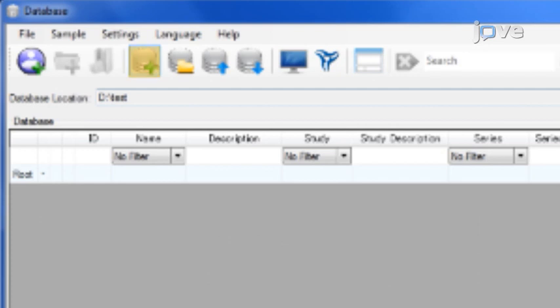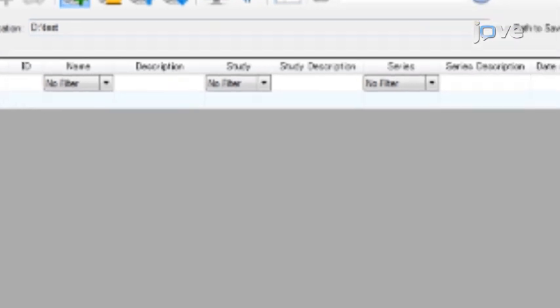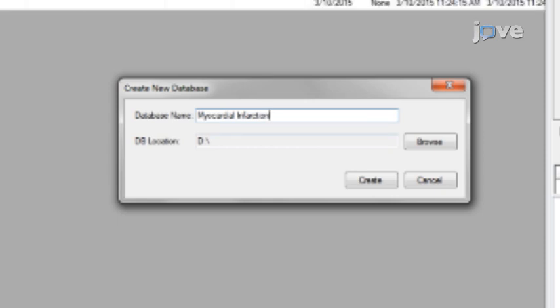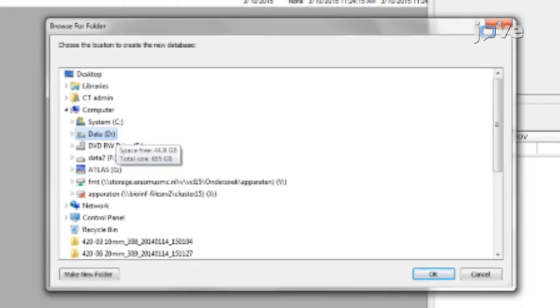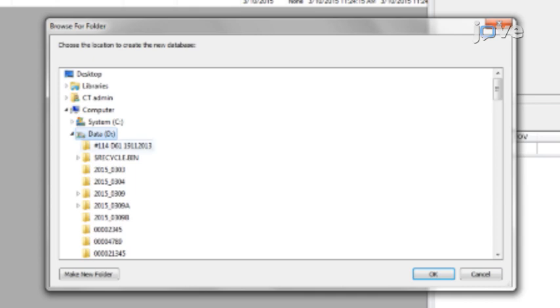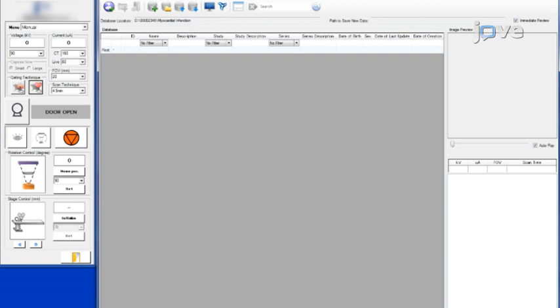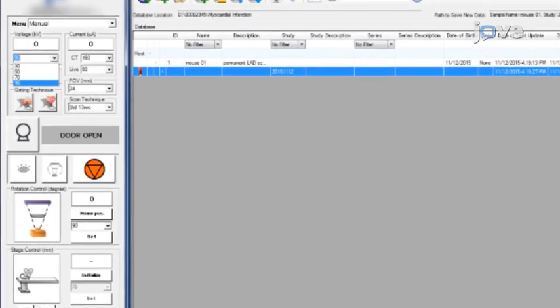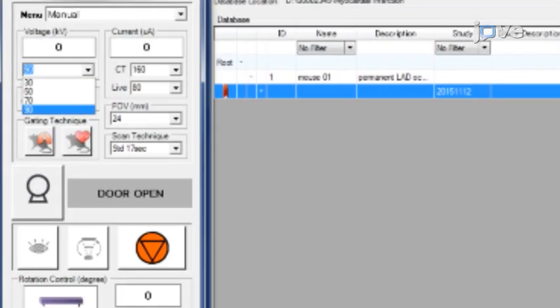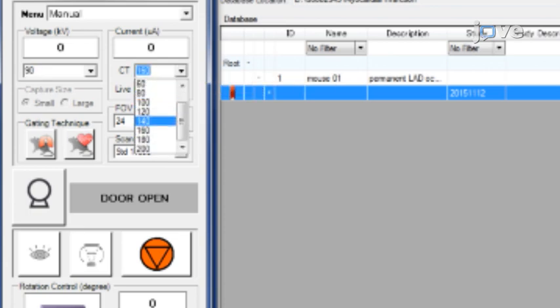Click the New Database button in the database window and enter a name for the new database. When the dialog box appears, click the Browse button and navigate to the drive where the database will be saved, then click OK, and observe the new database in the database window. To set the scan conditions, select the appropriate parameters.